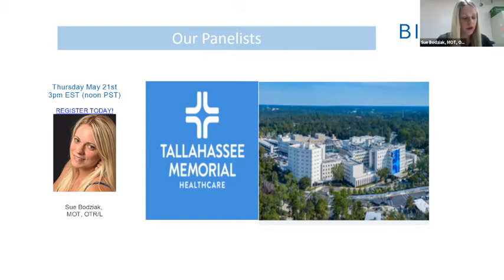Absolutely. So I really like to use the evaluation tool first off, just to do the passive assist on the 10 centimeter screen or the 14 centimeter screen. I do both just to see how much range they actually have and what will they be motivated to do. So the 10 centimeter screen is a little smaller, and then the 14 centimeter screen is a little bit bigger. So we get to see how much actual movement they do have. I get to see their strength, their coordination, but it also really determines their endurance.